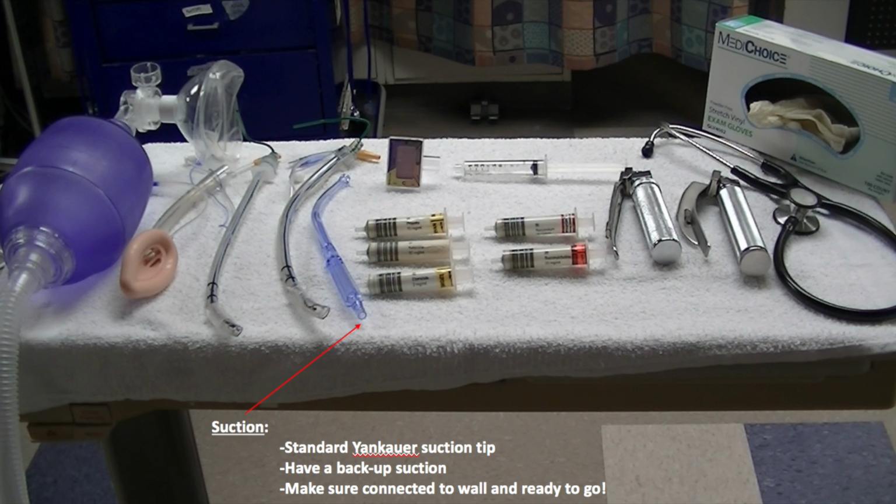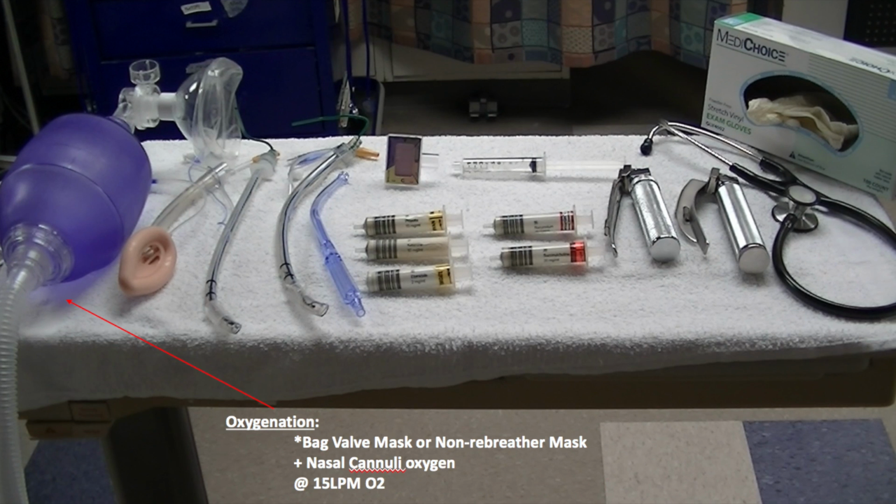What you see is a standard issued Yankauer suction tip. It's a good idea to have the suction plugged into the wall, turned on, and ready to go before you even start intubating. It's also a good idea to have a second suction tip at hand in case your first suction fails. Oxygenation. A critical step in intubation is to pre-oxygenate your patient, as we will demonstrate shortly. This allows your patient to maximize their oxygen saturation before you attempt to secure their airway. This is a bag valve mask.